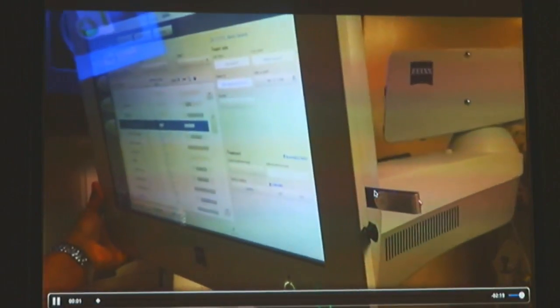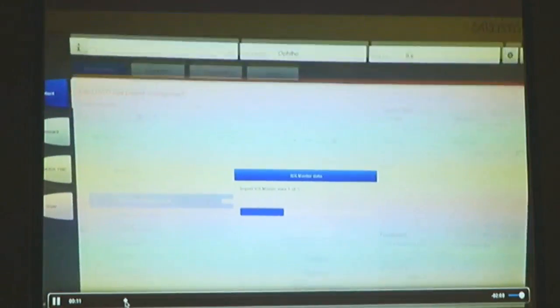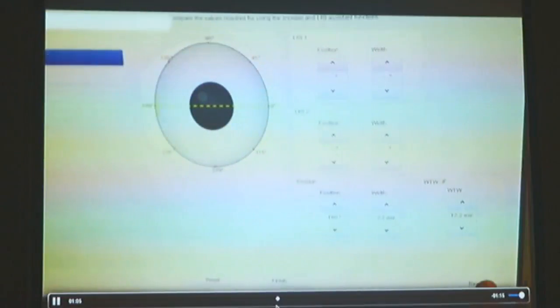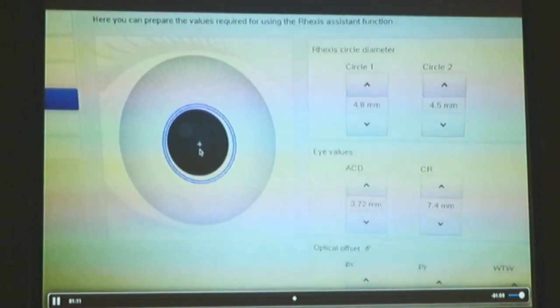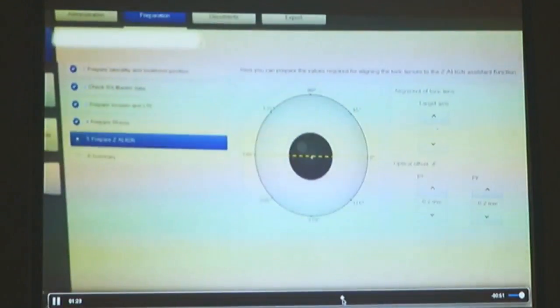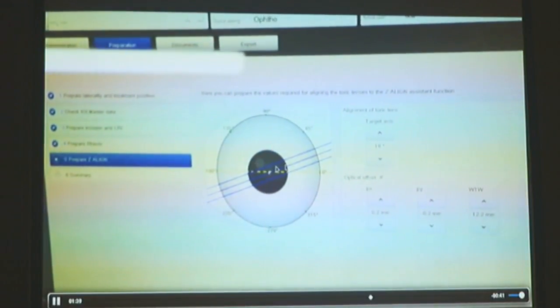Using these scleral vessels, the same scope on the microscope can then align these images. So here, for example, we've entered the data on the USB stick or network. We choose the patient information, we import it, and there's our data. We can then choose our incision position, center the capsulorhexis on the visual axis at the right size, whatever we want. We can then choose our axis of the toric lens, 19 degrees here, and set all our values up.